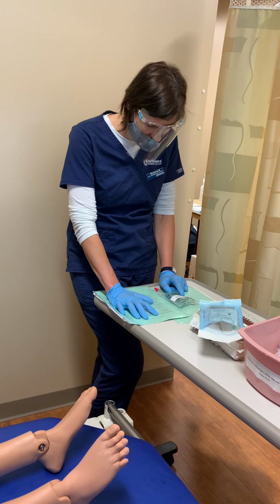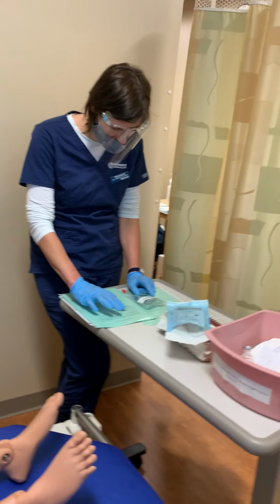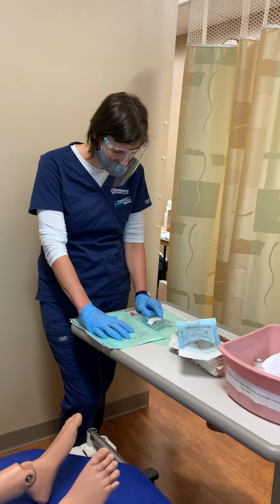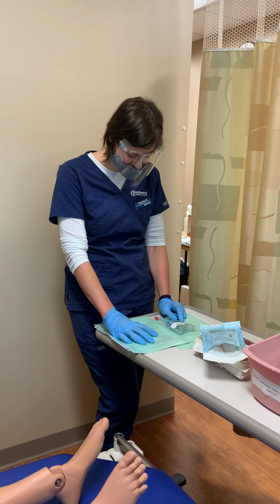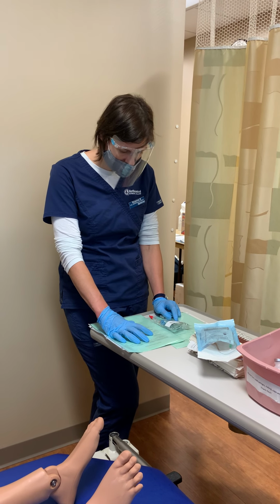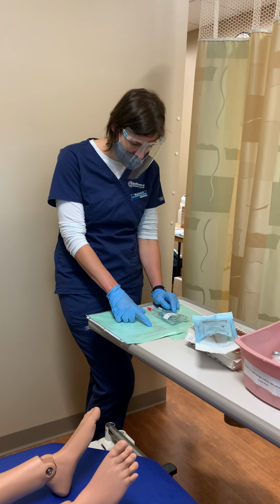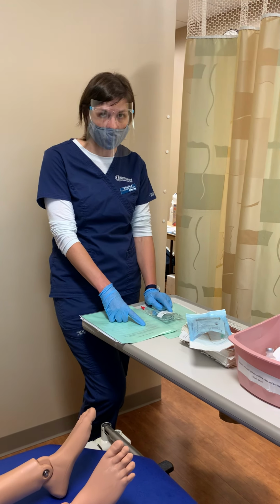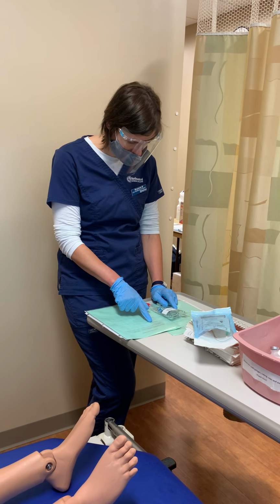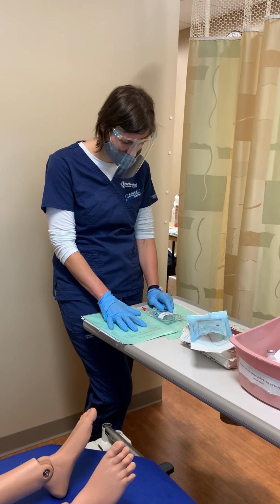And again, Frances Christensen is receiving the potassium chloride 10 milliequivalents in 100 ml via IV piggyback stat. And again, to clarify, that 100 ml will be run over 1 hour according to the recommended rate in Betty, which is my math calculation.